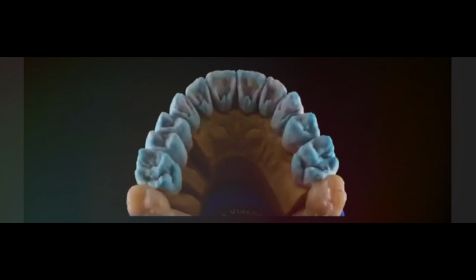It's very important, but also depending on the case, we need to choose sometimes to use monolithic, maybe occlusal surfaces, like here, as you can see, the second molar. It's not necessary to apply ceramic. Monolithic is okay for a second molar. Aesthetic is good and more strong.